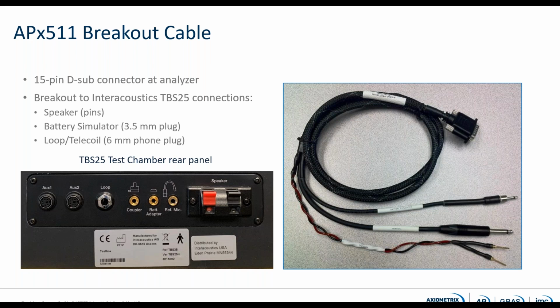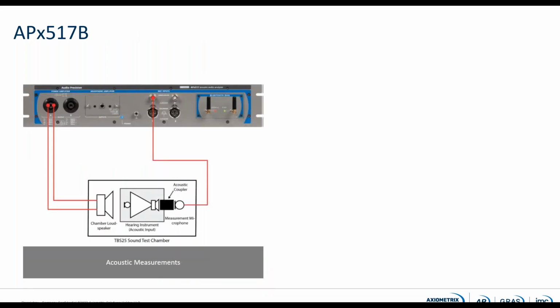It comes with a breakout cable to interface to the TBS25, and you can see there an image of the TBS25 rear panel. So I want to mention the APX517, and you can also use this to drive a loudspeaker using the power amplifier and obviously monitor a measurement microphone by the BNC CCP supply microphone input.